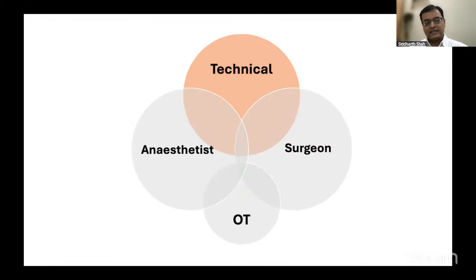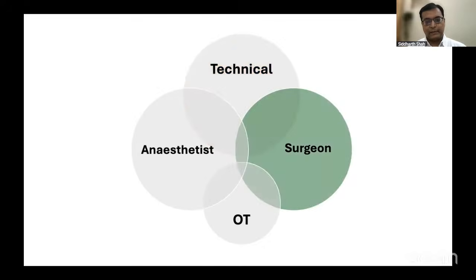But this tends to be something in which you are in close communication with the technical team as to what step of surgery you are performing, when the technical team needs to do a particular set of steps. Of course, the surgeon aspect lies at the core of the instrumentation work. When you're putting your screws in, when you're doing your corrections, all of this needs to be known by yourself. Of course, your skill would be vitally important, and we underline that when we're doing this as a deformity surgeon, you would have that expertise, you would have that checklist.